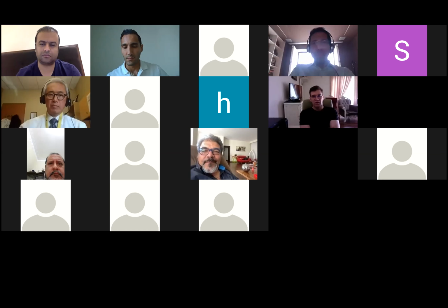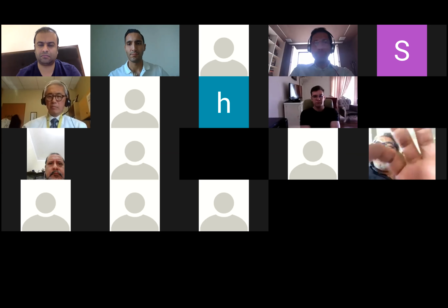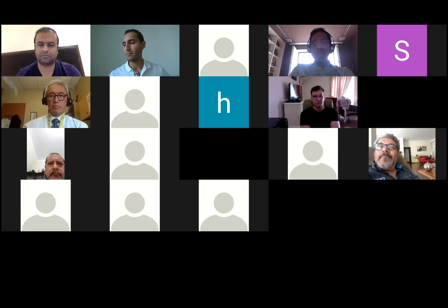Okay, hello again. Are you hearing me? Yeah. About one of the pitfalls of the TDR, as they mentioned, that's about the learning curve. So you have to be precise in the location of the disc and also the size of the disc, right? Right. As the first speaker showed, the technique is really the same.